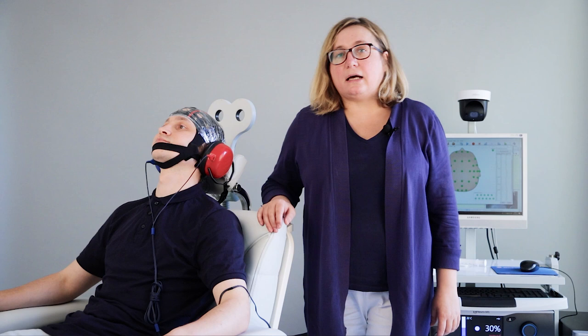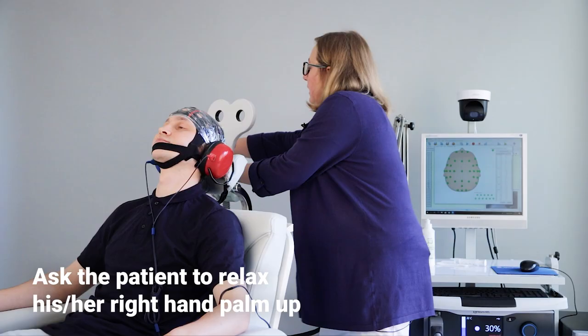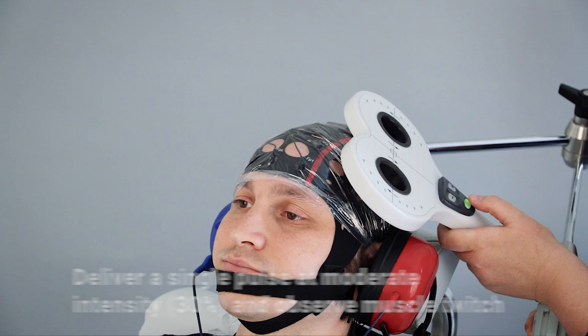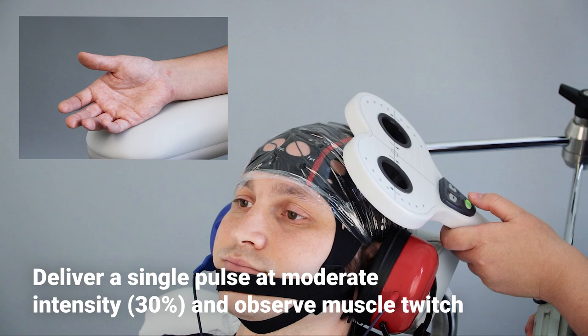Now we are ready to stimulate the motor cortex using a magnetic pulse. I ask the patient to relax his right hand, palm up. I loosen the screw on the holder arm. I put the center of the coil on C3 according to the 10-20 system at 45 degrees to the sagittal line, and deliver a single pulse and observe muscle twitch.